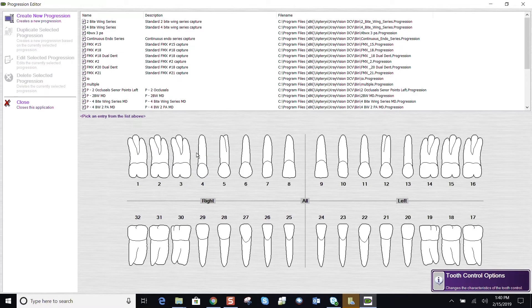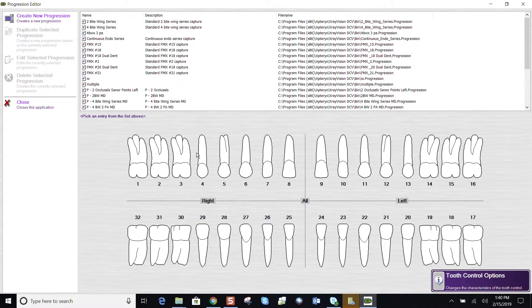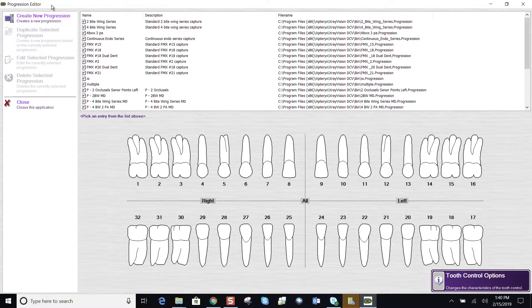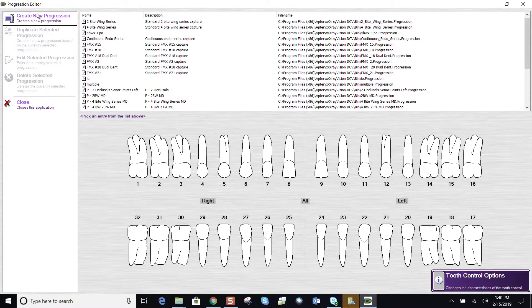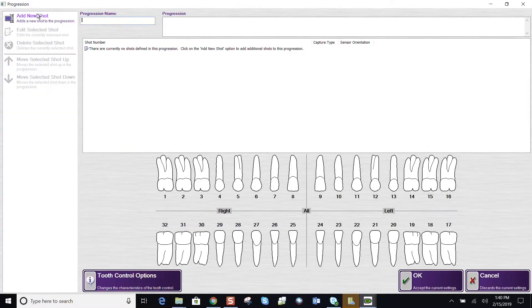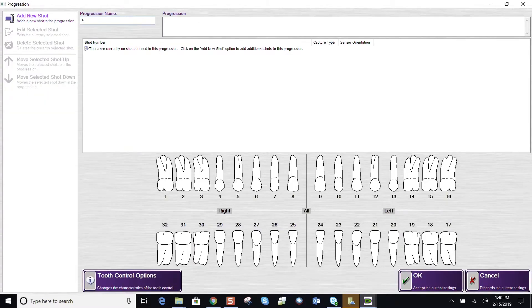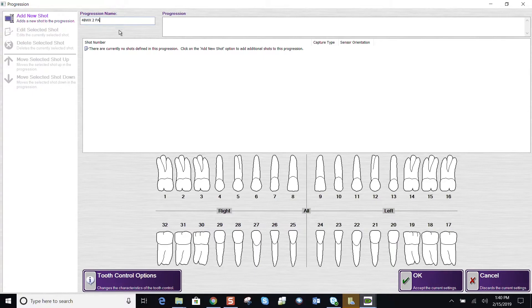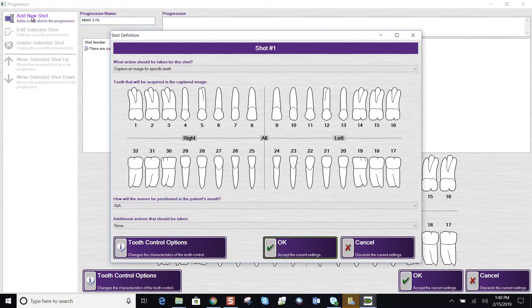And here's where we create or edit our progressions or layouts or formats. Upper left-hand corner, let's click on create new progression. Let's call this one a four bite wings and two PAs. Upper left-hand corner, add new shot. So this gives us our adult tooth charting.